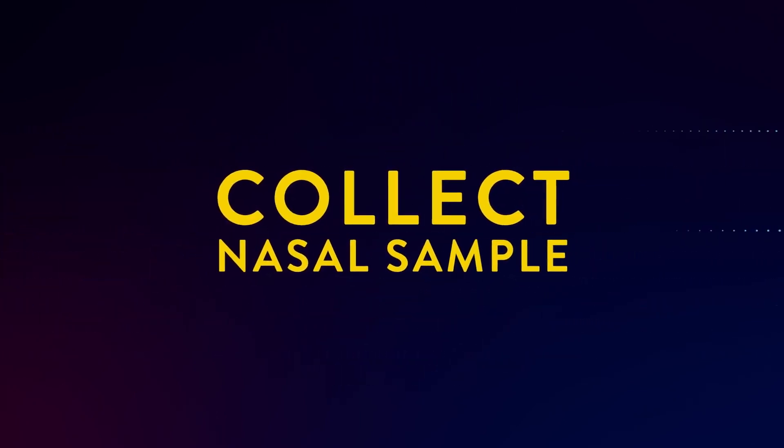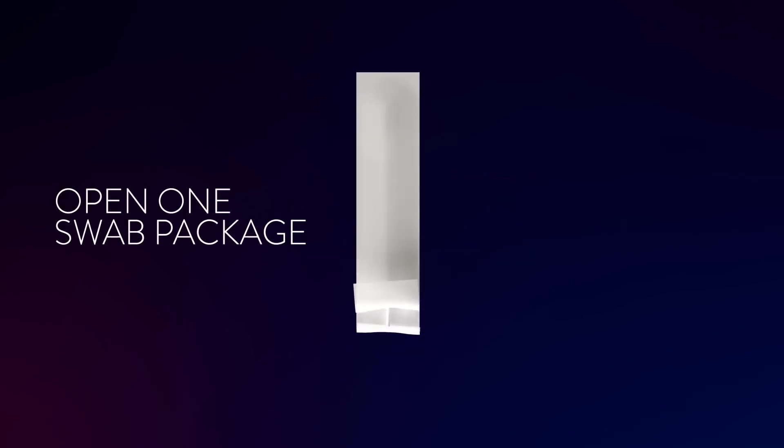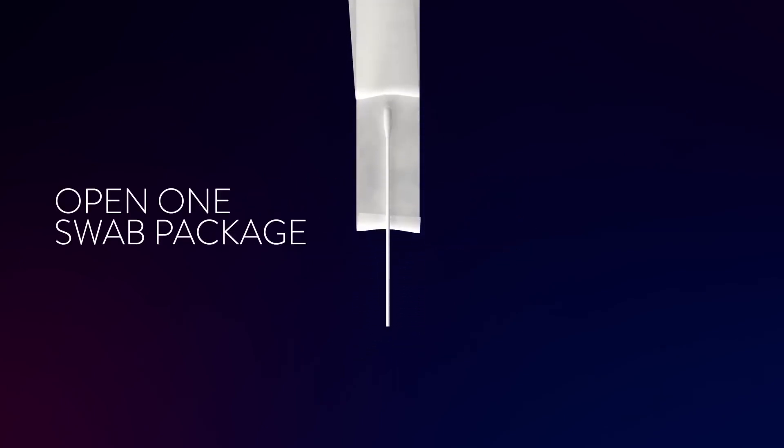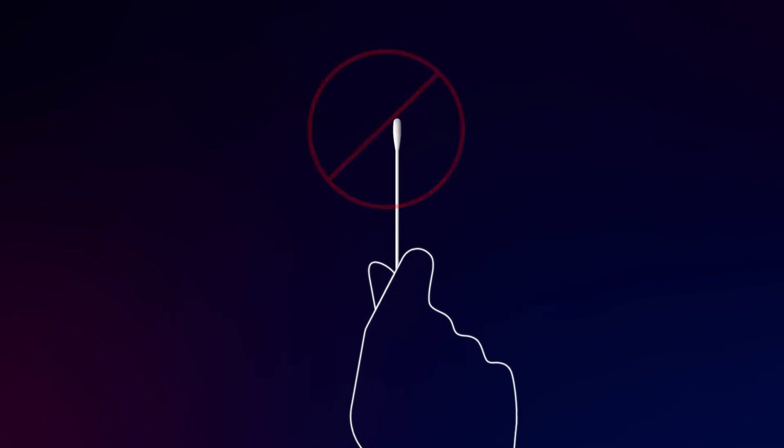Now, collect your nasal sample. Open the swab package at the stick end and remove the swab. Be sure to keep your fingers away from the swab end.